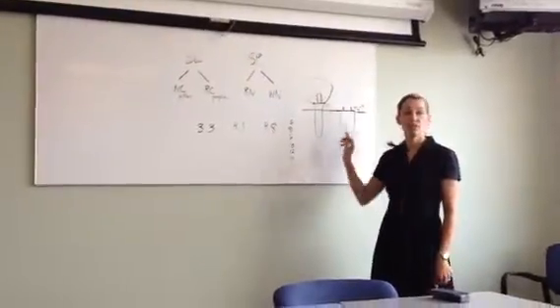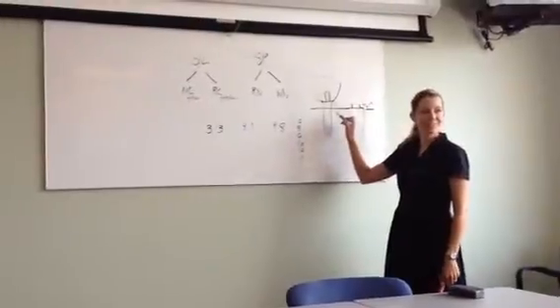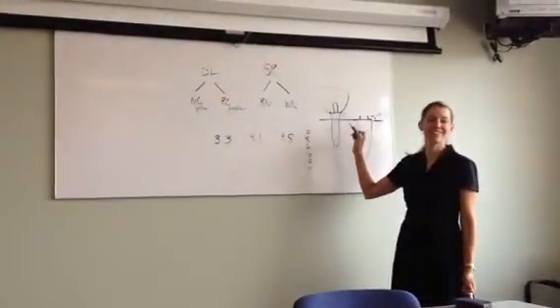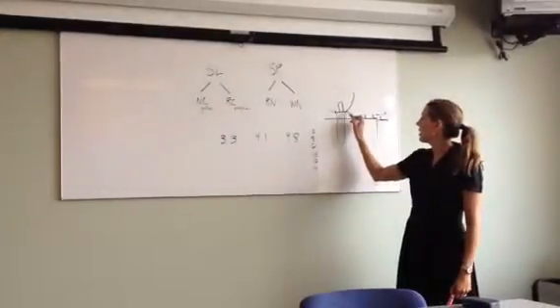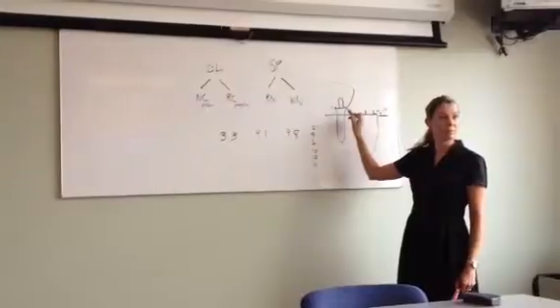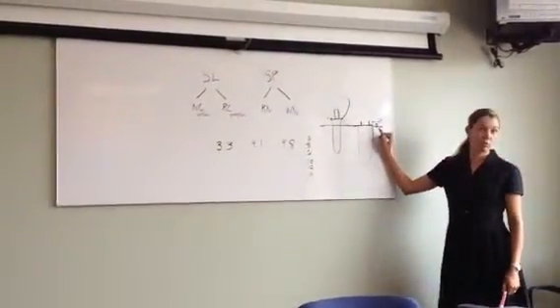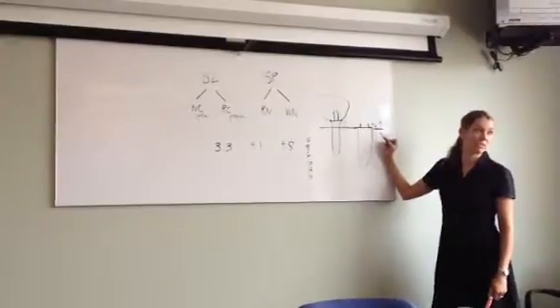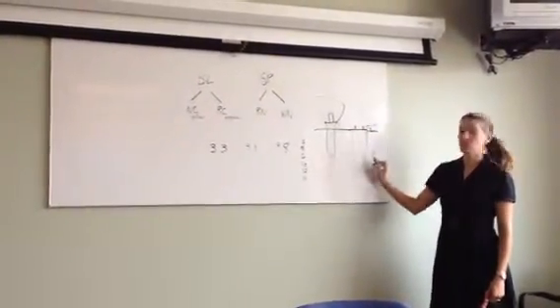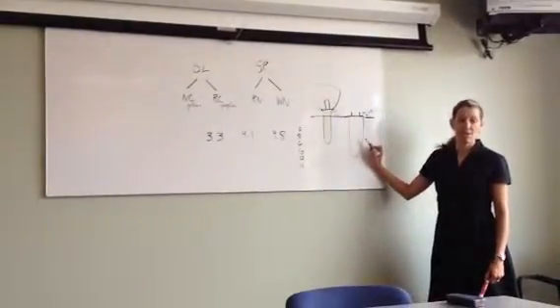So your microgap, or your connection, is raised up above the surface of the bone. All right? So with a tissue level implant, what are your two collars? Regular. Yes, it's not a trick. And we have really good bone maintenance because we've raised up our microgap. With a bone level implant, we do not have a raised platform, but we have a platform shift instead, which protects the bone. So these are the two styles of implants that Straumann offers.